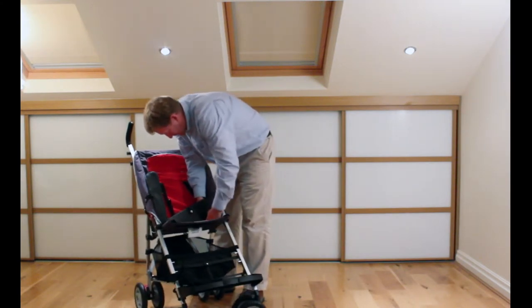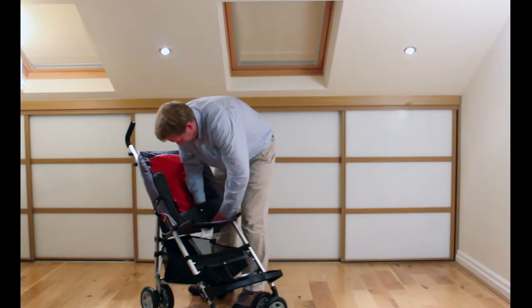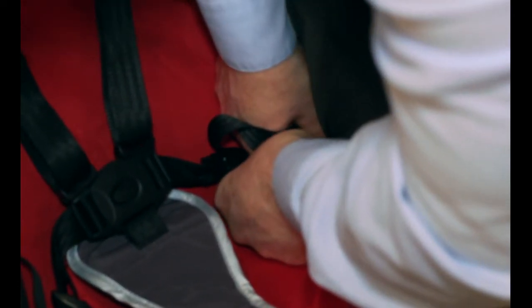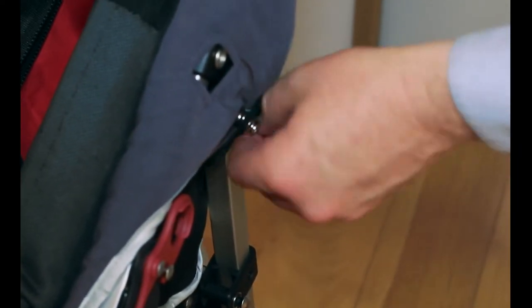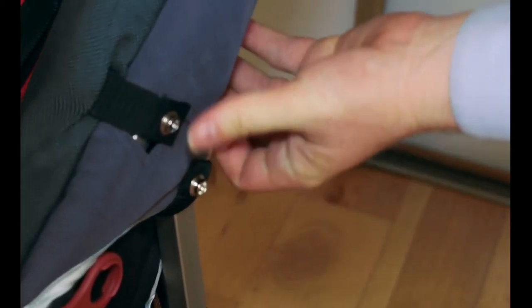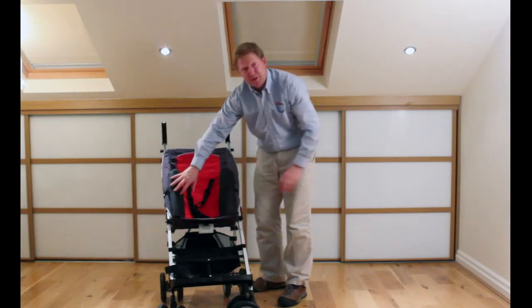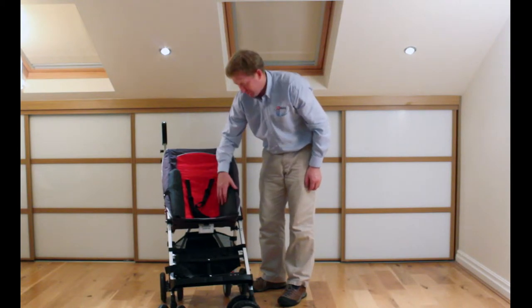The easiest way to do it is to put it sideways and then push it on and turn it around. The next strap goes through the side and then clips onto the side of the Do Buggy, and then the last strap comes over the top and onto that eyelet there. And that's both lateral supports in — you do the same on the other side.